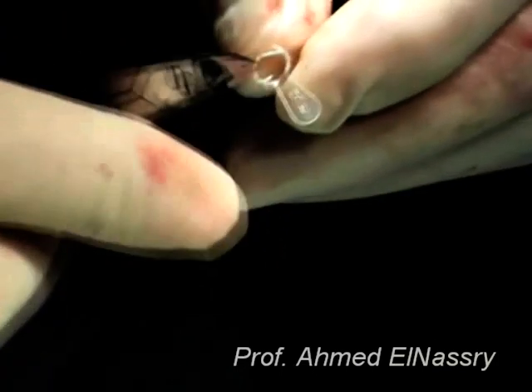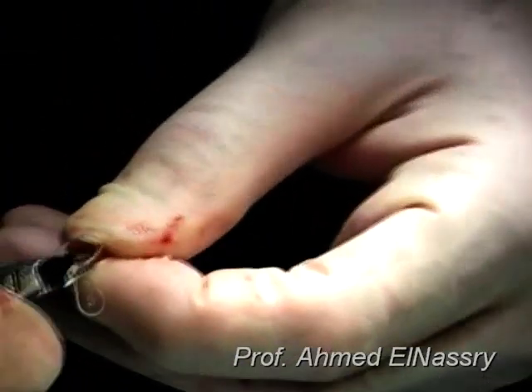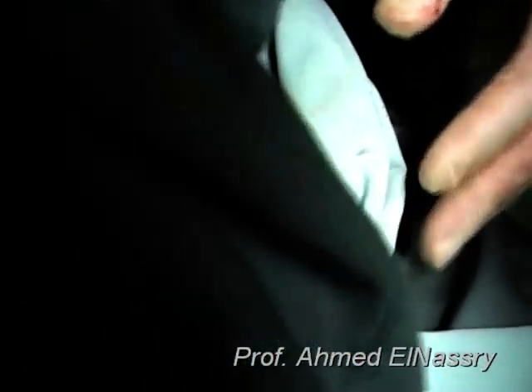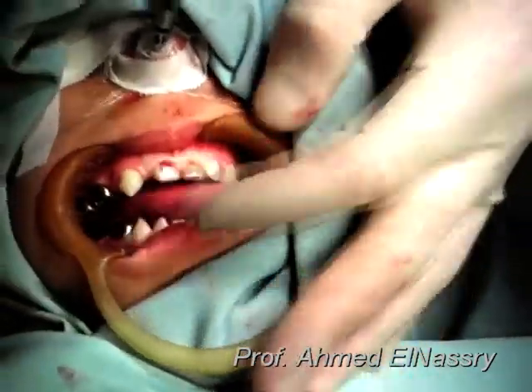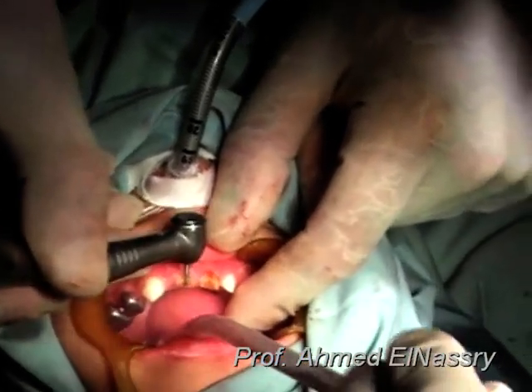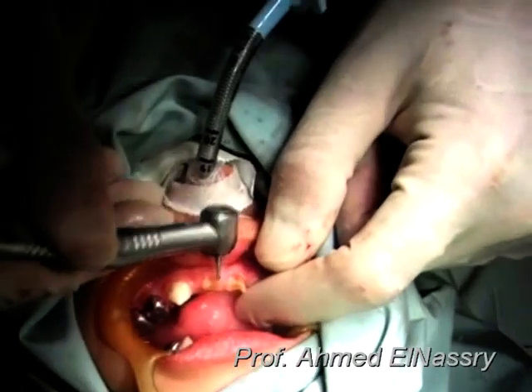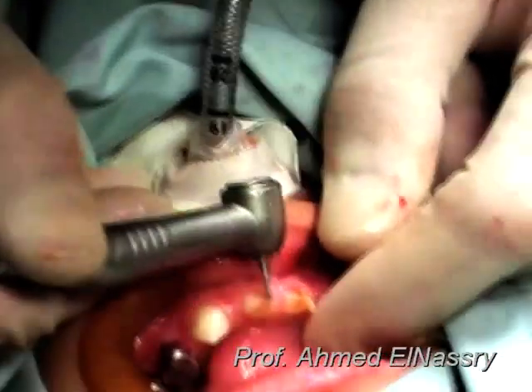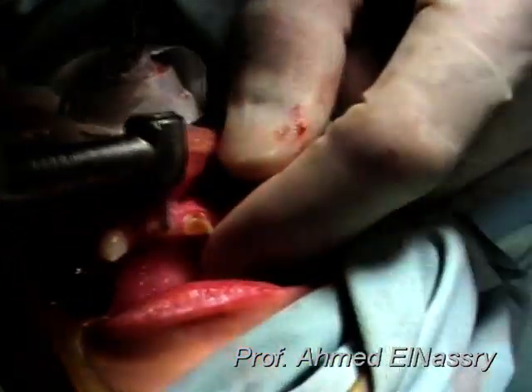We have now the tooth 61, adjusting and contouring the celluloid crown. Try the celluloid crown. Starting removal of the dental caries from both teeth, 51 and 61.